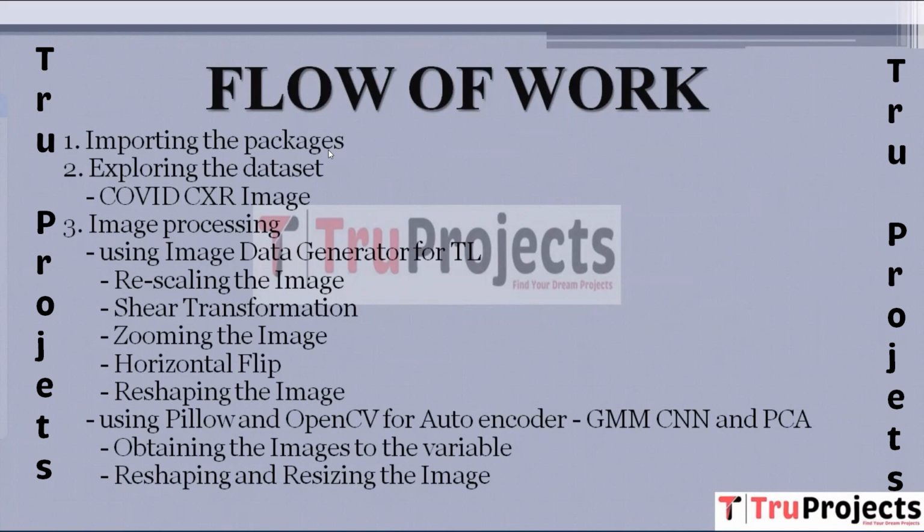Third, here we have image processing. This section is divided into two parts. First, using image data generator for transfer learning, TL, for CXR. Rescaling the image, shear transformation, zooming the image, horizontal flip, and reshaping the image are all parts of the image data generator for transfer learning for the CXR. Then next, we have using Pillow and OpenCV for the autoencoder, which includes a GMM, CNN, and PCA for CXR.